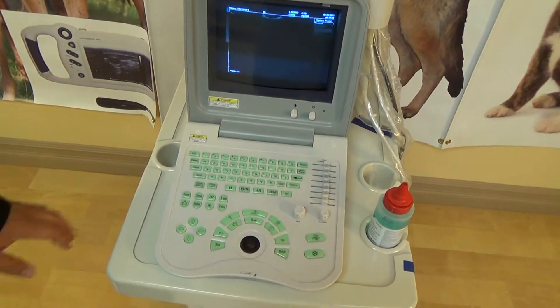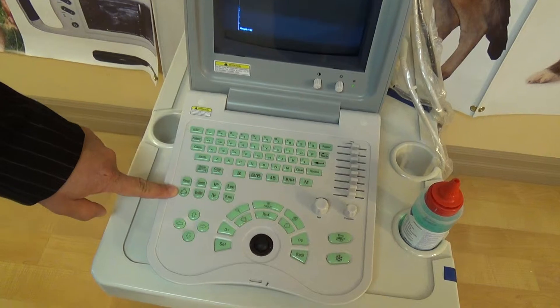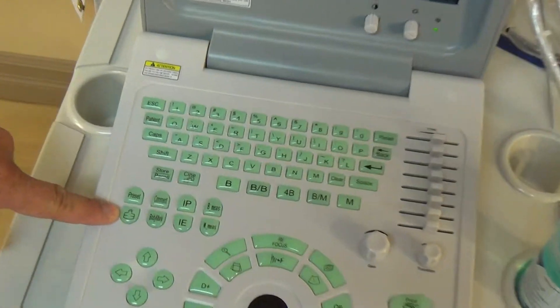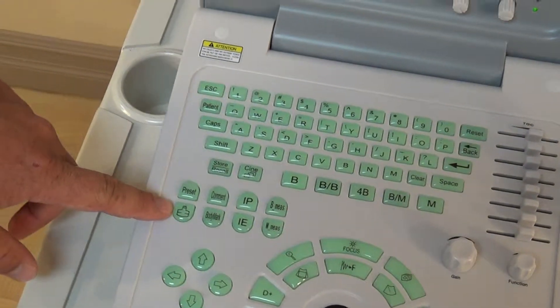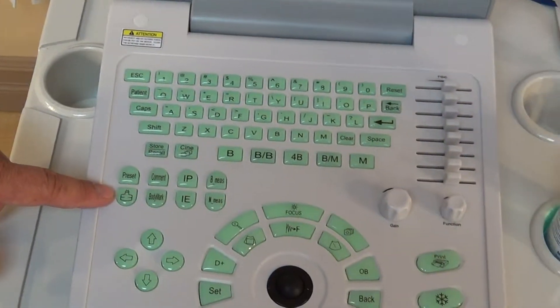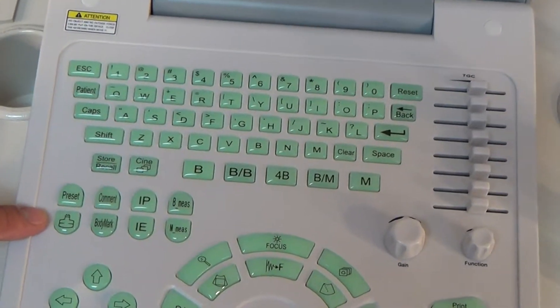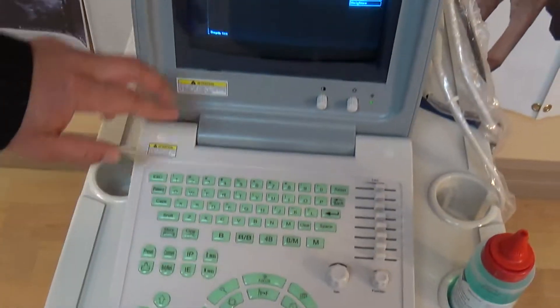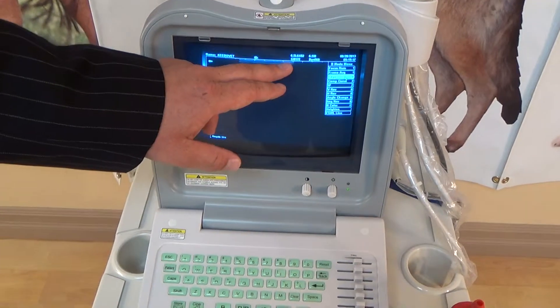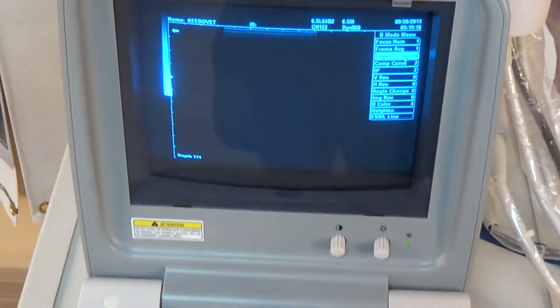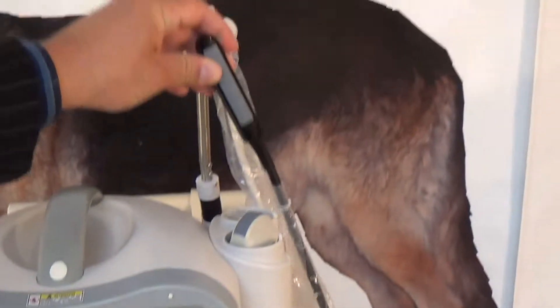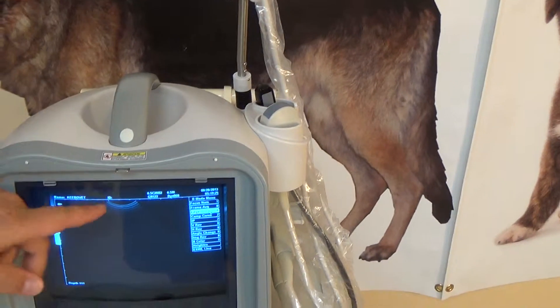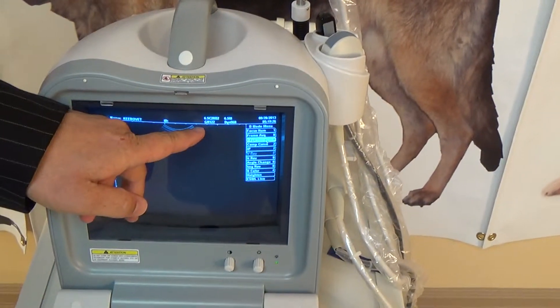Back to the keyboard, we have the next button here — this is the ultrasound probe button. It's a standard image for ultrasound probes, and that just selects between your ultrasound probes. When I hit it, it automatically switches to our linear probe, which you can see over here. And then when we press it again, it goes back to our curved probe. You can see how the image screen changes.